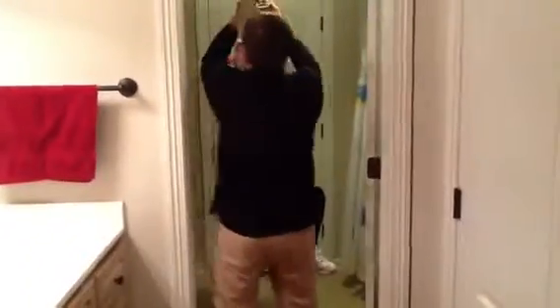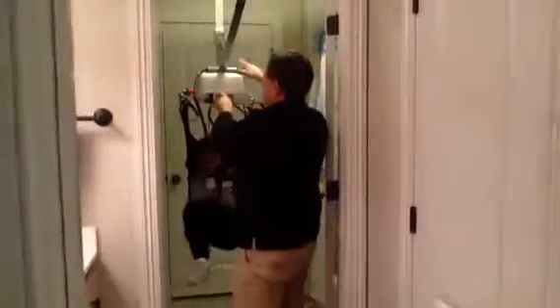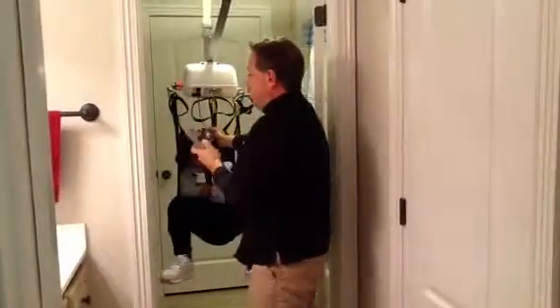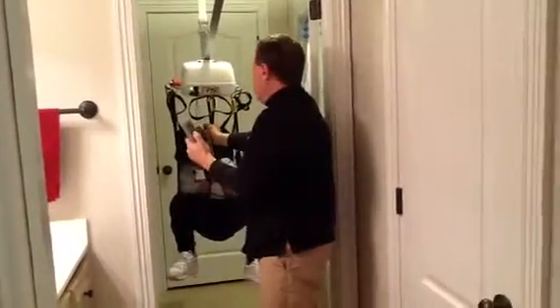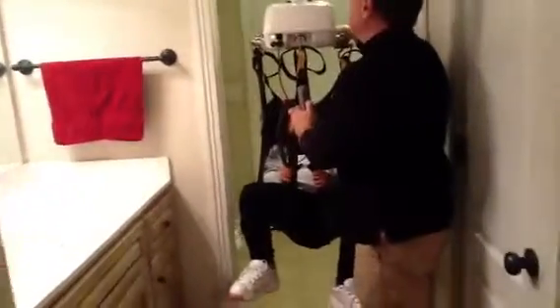Now we're going to do the same thing coming back out of the bathroom. You're doing a great job, Bree. Attach at that severe angle into that — both straps are now attached. We're going to flip that lever in the direction we're going to go, hold on to Bree again, push that up button, and begin to transfer. And then we click again.